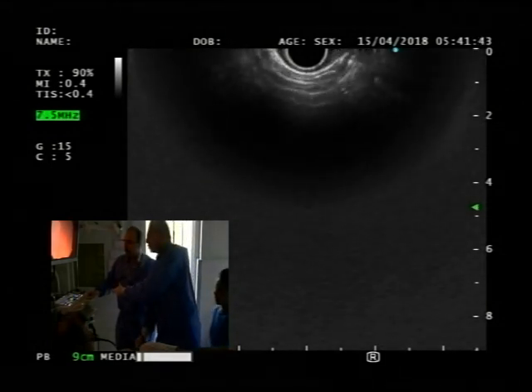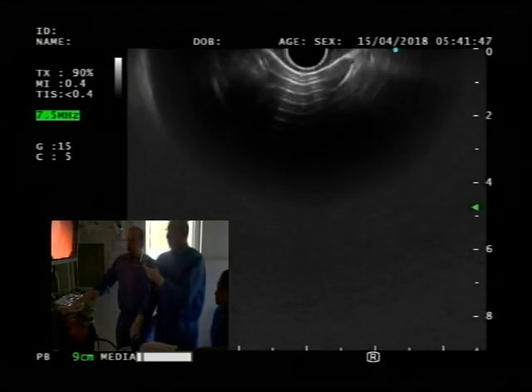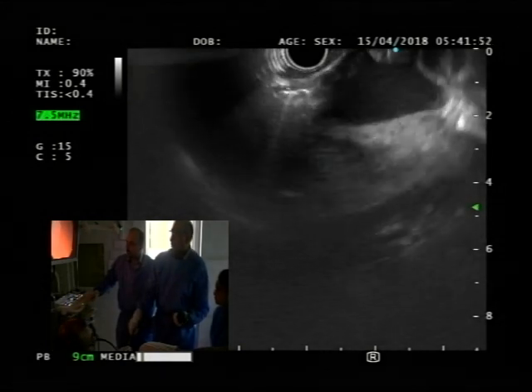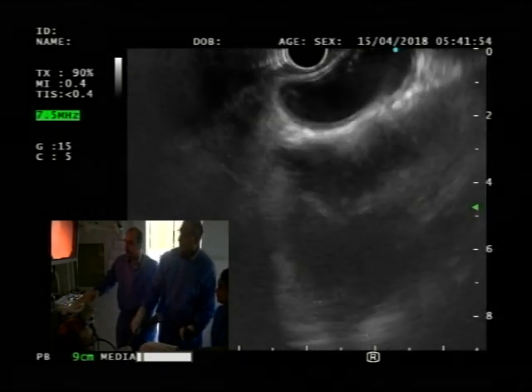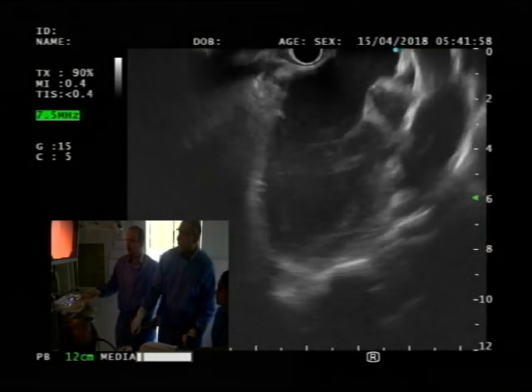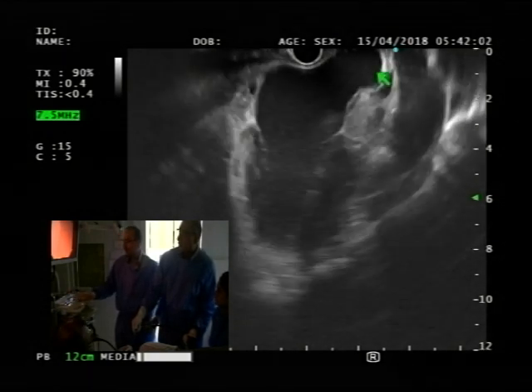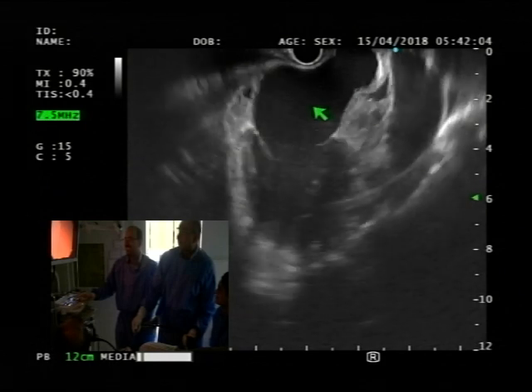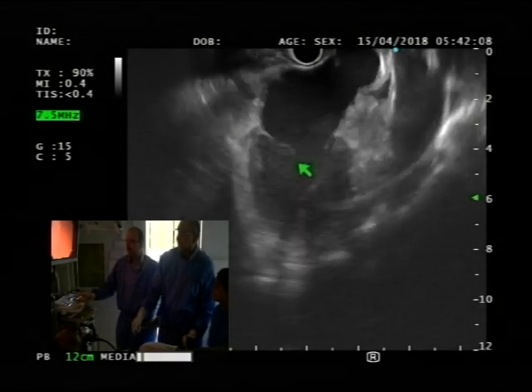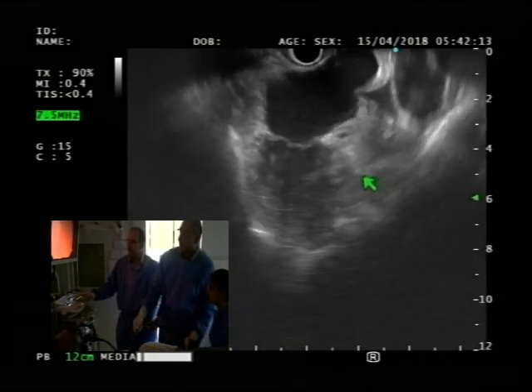Okay. Go the other way. Counter. It's okay. Keep going counter. Keep going. Drop your hand. Keep going all the way. There we go. Okay. So now you start seeing recognizable structures, right? So I will test you. What's this? That's the mitral valve. Yeah, mitral valve. So left atrium, mitral valve, ventricle, and then show me the aortic arch.